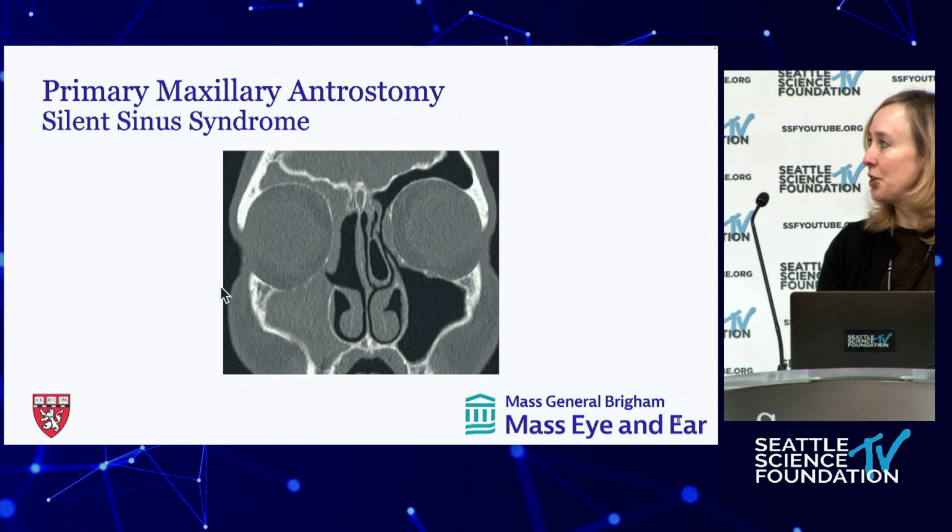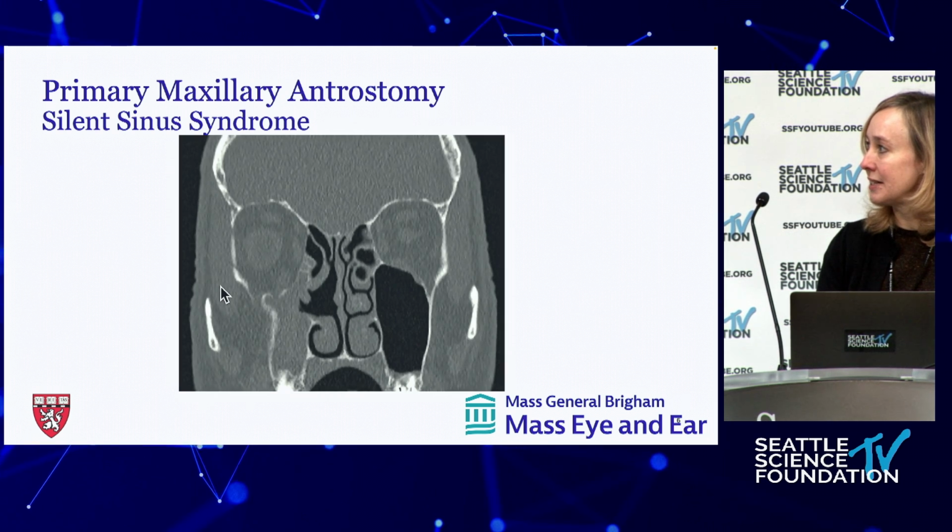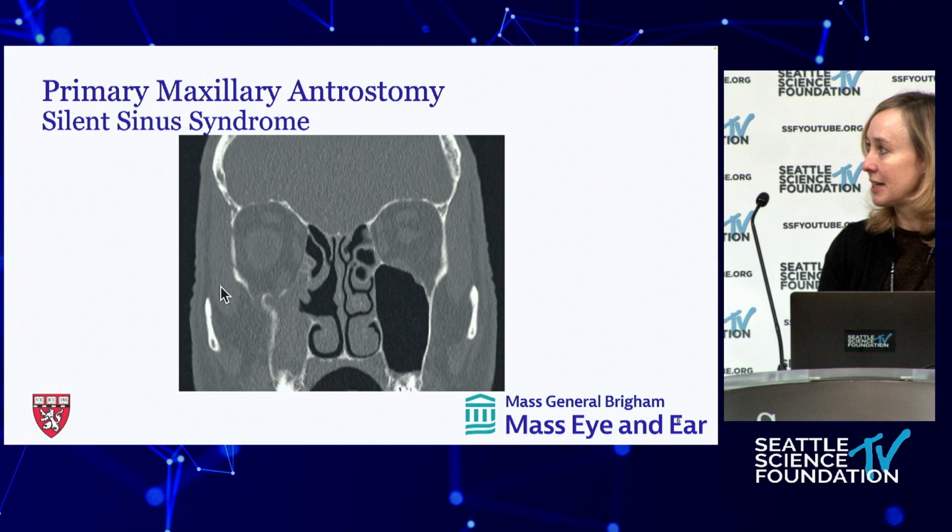So this is the patient who has silent sinus syndrome. This is sort of the same scan.